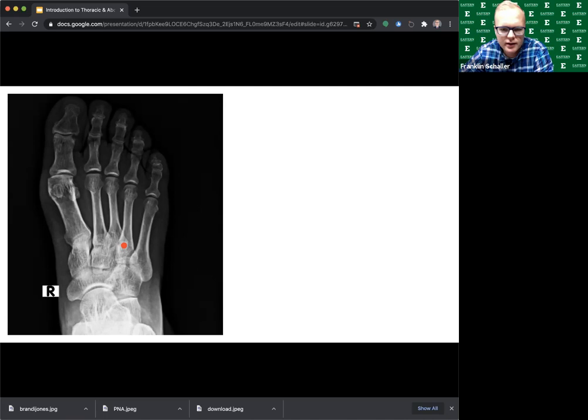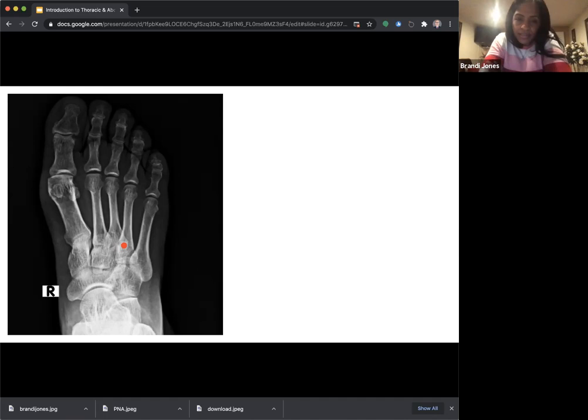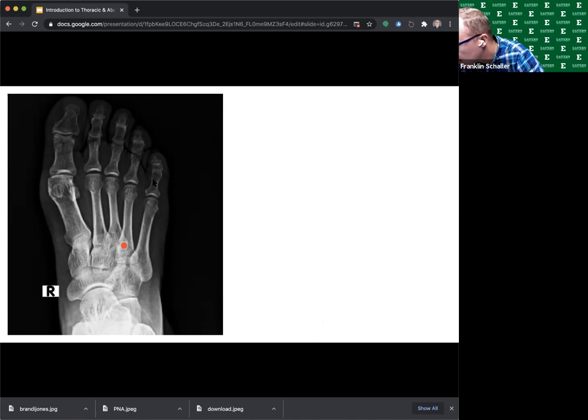Looks like she has a pinky toe fracture. I would agree. So looking at this bone here, there is a black line going through and through. More obvious on the medial side over here. You can see it protruding, sticking out a bit. So this is treated with buddy taping, rest, ice, compression, elevation, over-the-counter analgesics. This patient will be just fine.